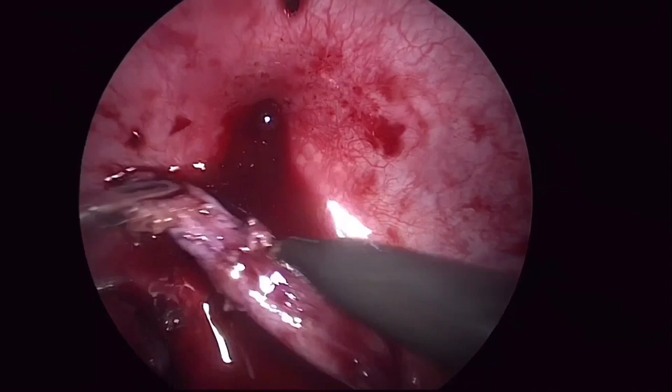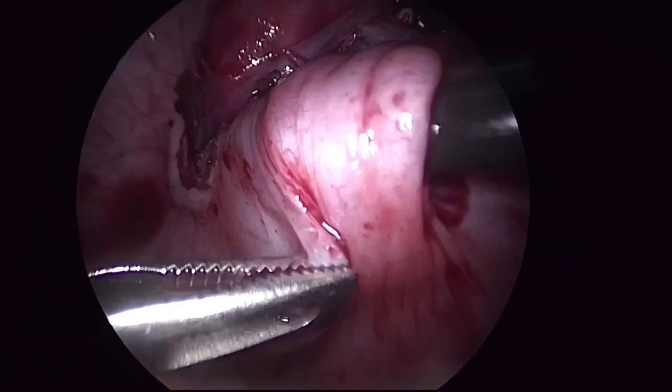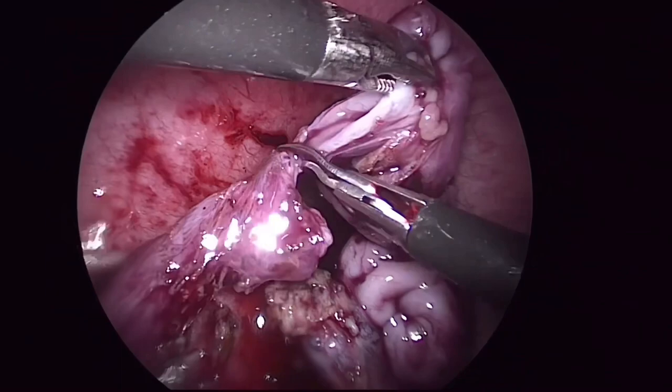A submucosal tunnel is created for the left ureter. You can see the entire length of the submucosal tunnel is in the ratio of 4 to 1. The terminal part of the dilated left ureter with the Hutch diverticulum is then excised, and the left ureter is then passed into the submucosal tunnel.